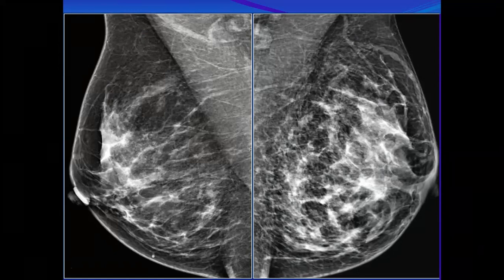It is BIRADS with associated features. It is BIRADS 4C, because it can be mastitis. You cannot guarantee. The lymph nodes and the prepectoral edema make it a little bit more suspicious. And even here, some distortions. The edema and subtle distortion make the pectoralis not very clear. But still, if there is a lot of infection and the whole breast is involved, it might be mastitis. But these features are suspicious.